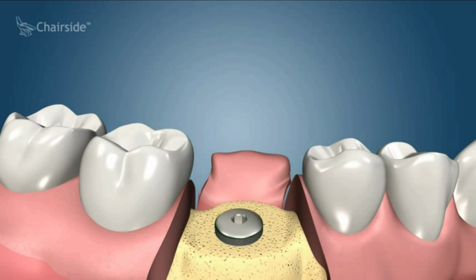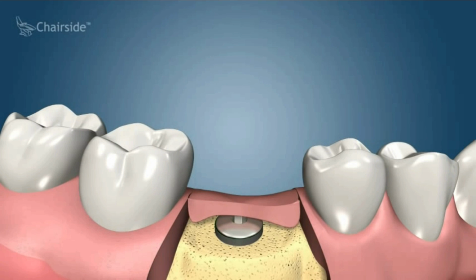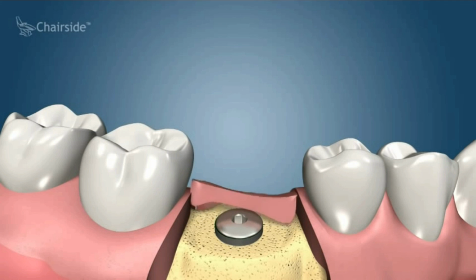The flap is then repositioned over the implant and sutured into place. After the appropriate waiting time, the implant is exposed, the cover screw removed, and replaced with the healing cap. The tissues are then repositioned around the healing cap and allowed to heal. After the appropriate healing time, the healing cap is removed and the crown base and the implant crown are placed on the dental implant fixture.